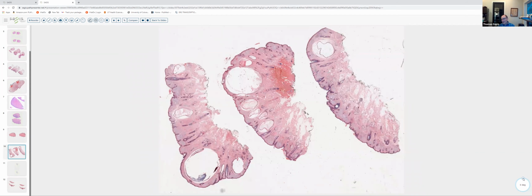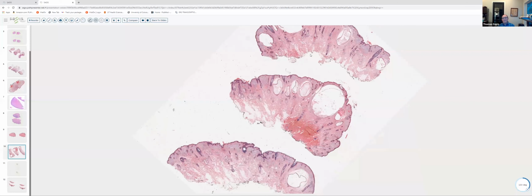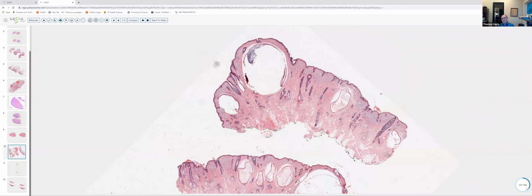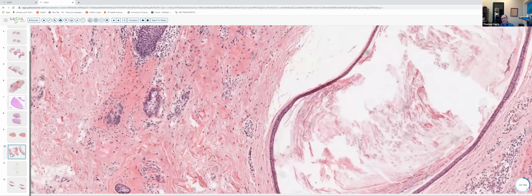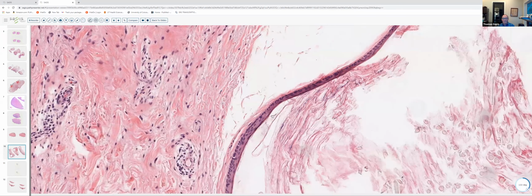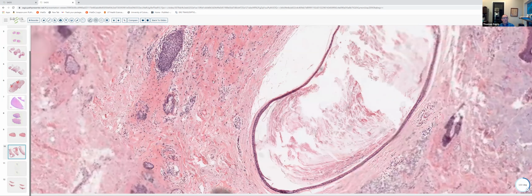The next case doesn't get biopsied very often, just a beautiful example, and you kind of need to look at it at scanning magnification or low power to make the diagnosis. Here we've got a lot of milia in the dermis. You can see these cystic dilatations, which are filled with laminated keratin. You actually have trichostasis spinulosa here with a lot of little hair shafts. And one can see stratified squamous epithelium with retention of a granular layer. So these are milia, or small follicular cysts.